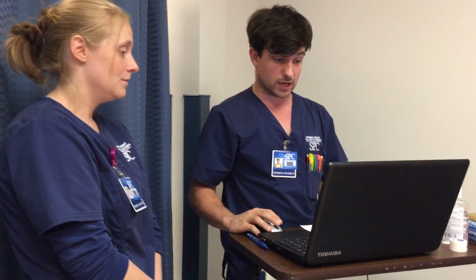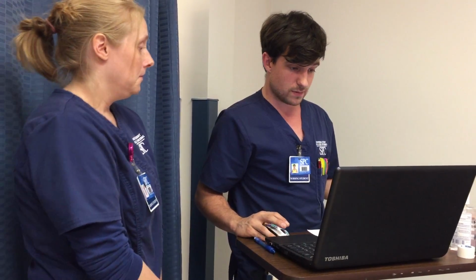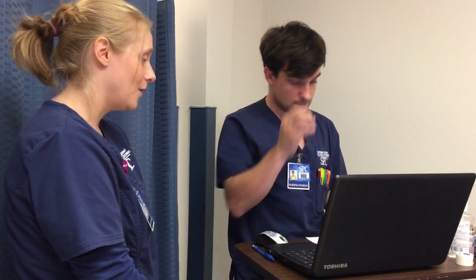Okay. Here's our medication. We are just going to check it one more time before we draw up, right as we're drawing up the med, that we are doing the right med, right route, right dose, right time, and right patient, okay? So let's go ahead.